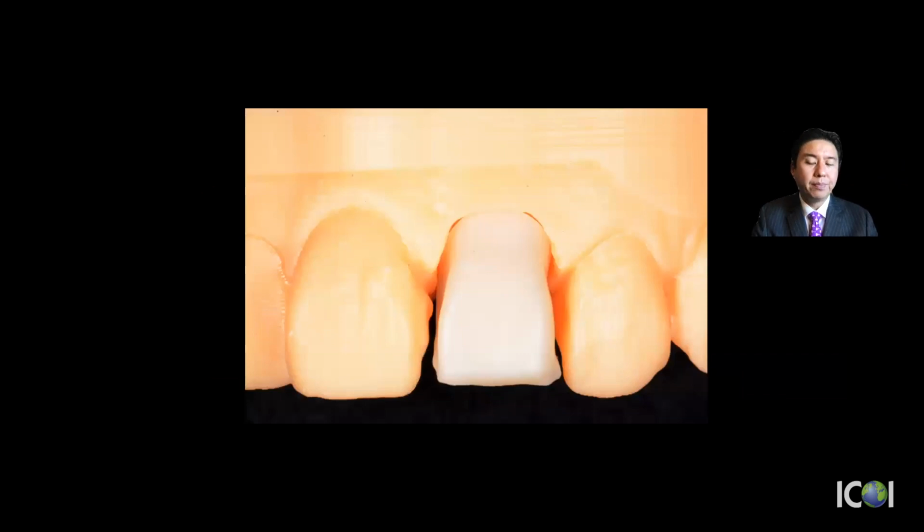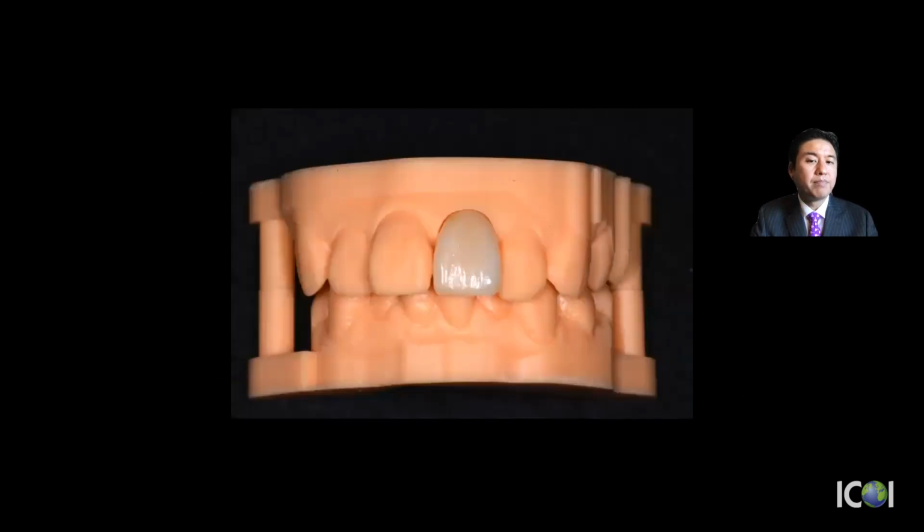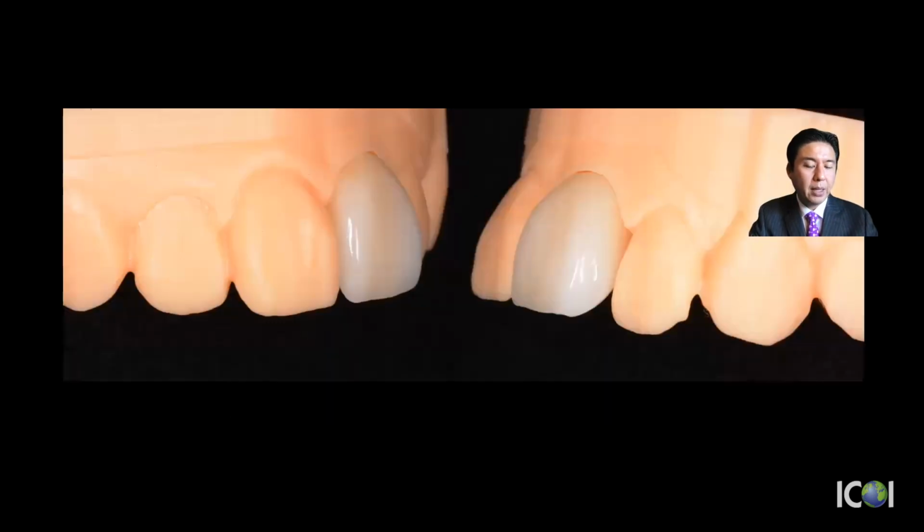Now I have a model, like a normal one. So I asked the technician to put the porcelain on the top, the layer of the porcelain, and then make a natural, nice-looking contoured tooth. You can see the morphology on the facial area and also the gradation of the color, which is difficult to make with only a milled crown.